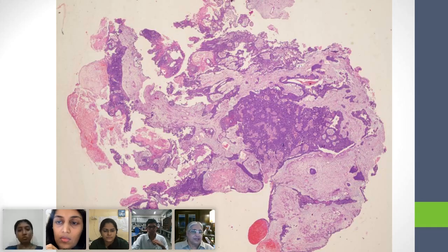Yes. So there are these irregular spaces, and we don't call them glands until we know that it is a gland. Now, will anybody define for me what is a gland? Because, okay, Ashish, you used the word gland. Now tell me, what is a gland?